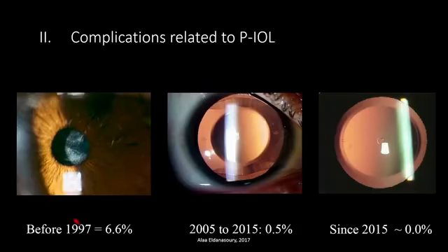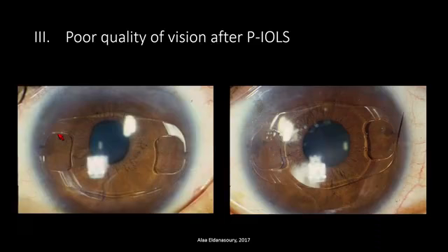surgery easy. Posterior chamber lenses, the worst case scenario is developing cataract that was relatively more common in the early designs 15 years ago. Now with the V4, it was much less. With the V4C, since the introduction of the central hole, in my hands, I'm using this for 3 years now, and so far I didn't have a case of cataract.